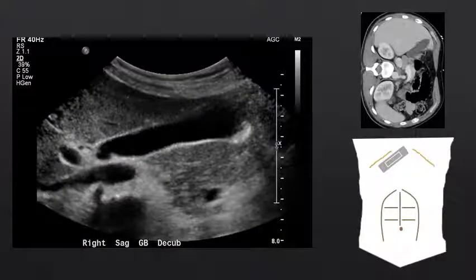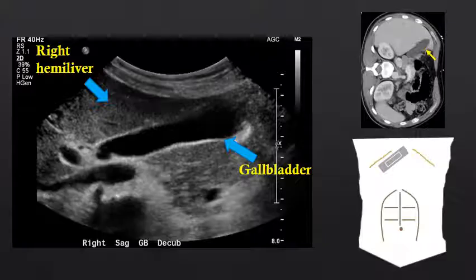If we slightly adjust our probe and remain in a subcostal location in a somewhat oblique transverse orientation, we now see a hypoechoic fluid-filled structure come into view. That is known as the gallbladder. The gallbladder has a thin hyperechoic wall with only one layer and hypoechoic internal fluid. It is just deep to the right hemiliver in the gallbladder fossa, and it divides the right hemiliver from the left hemiliver.